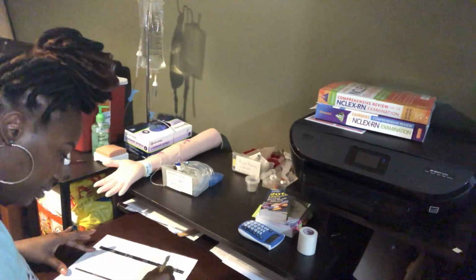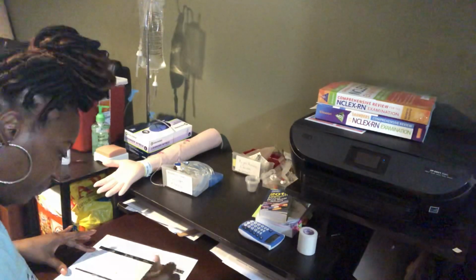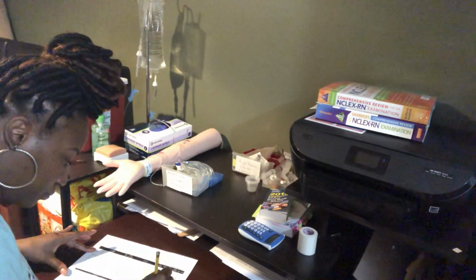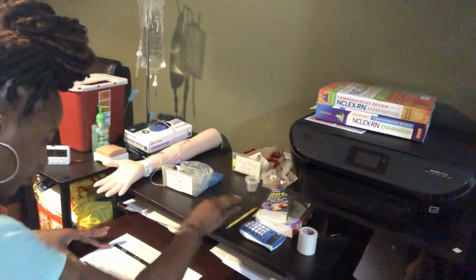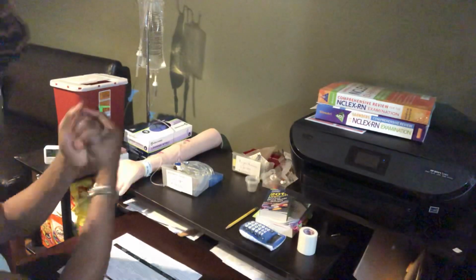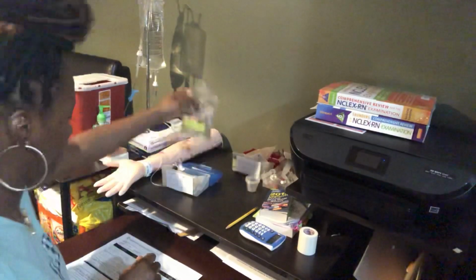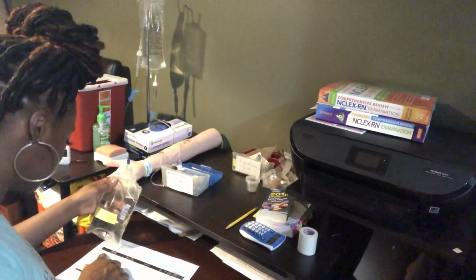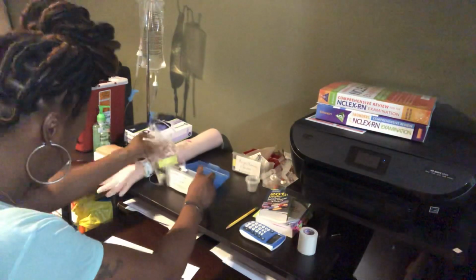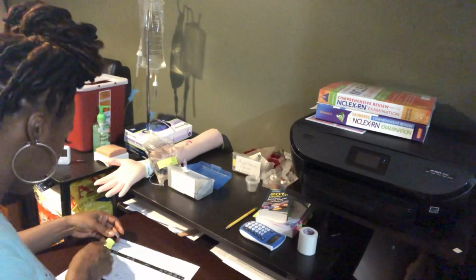Circle for the Lasix. Non-red, no swelling. So that's good. I can go ahead and give the IV push and go ahead and give the antibiotic IV mini bag. So let's see what I'm giving. Cefazolin, 100 milligrams. Regular insulin, U100.